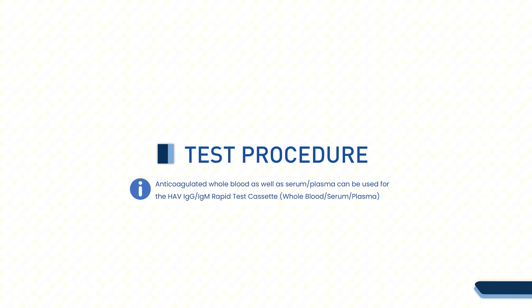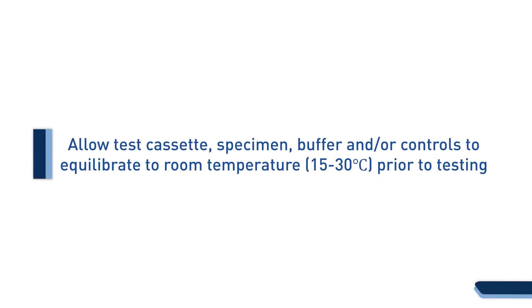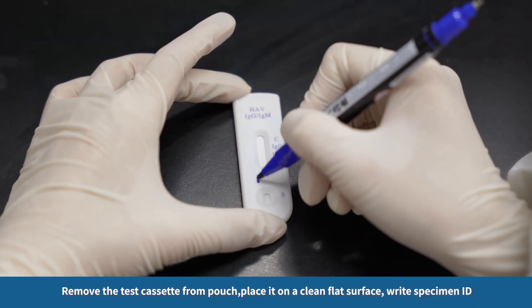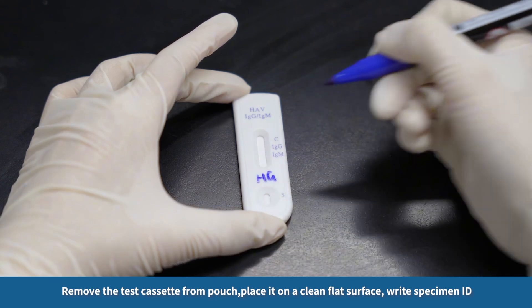Allow the test cassette, specimen, buffer, and controls to equilibrate to room temperature — 15 to 30 degrees Celsius — prior to testing. Remove the test cassette from the pouch, place it on a clean flat surface, and write the specimen ID.